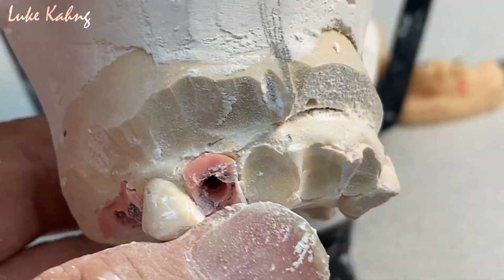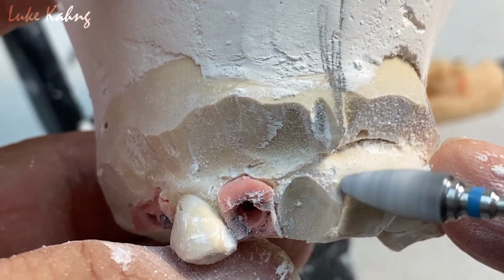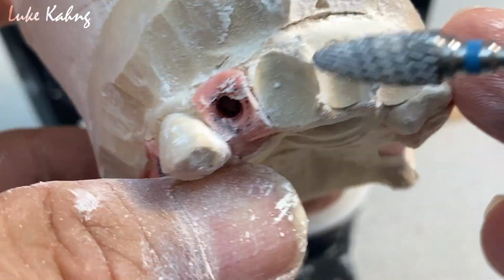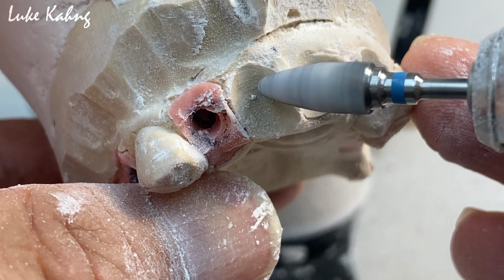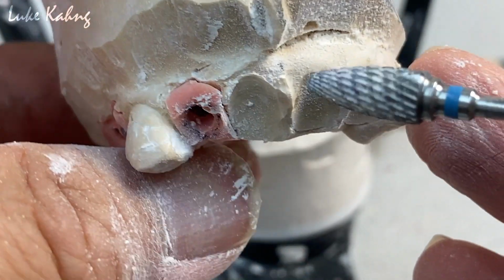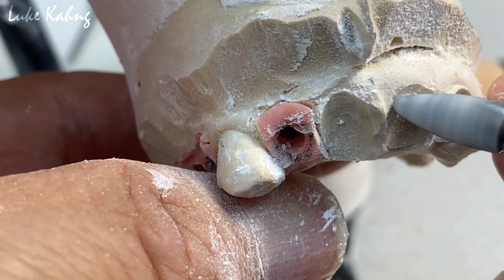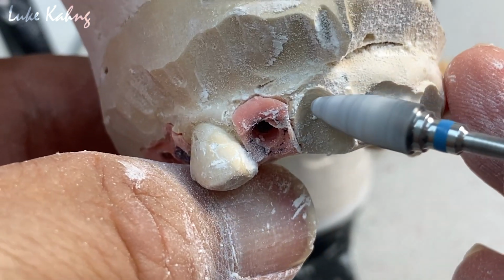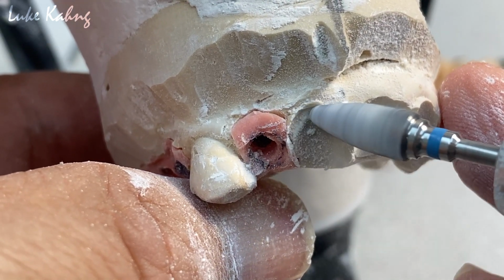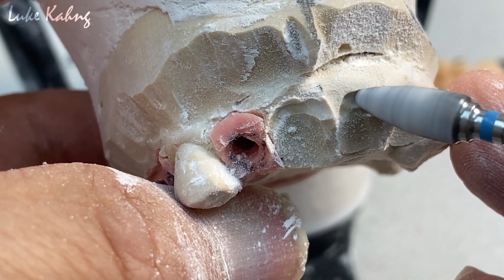Okay. Now you see the facial contour. It just comes in with the line. You don't have to make moves. That's good. I respect the tissue contour facially. Okay. Just like the other. But remember, this is the aesthetic start.